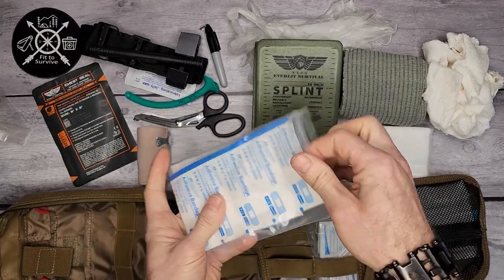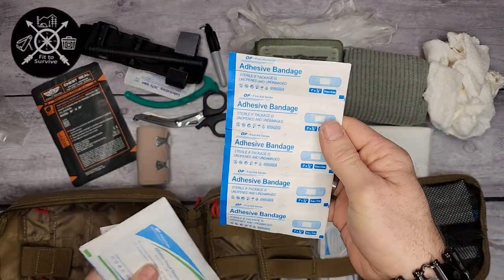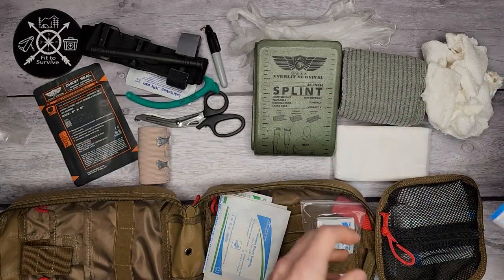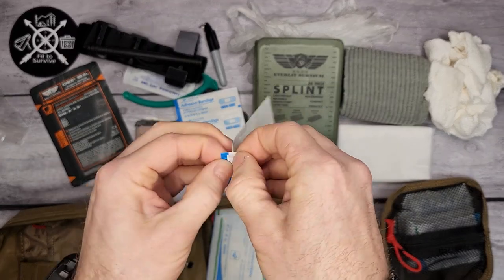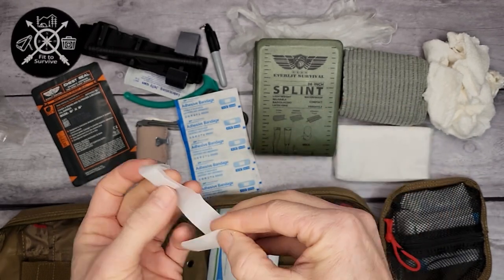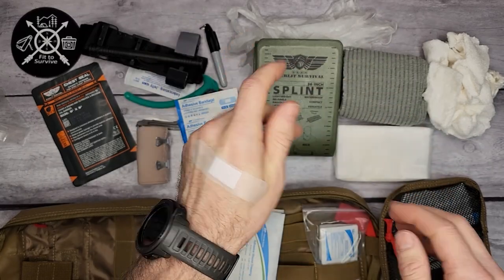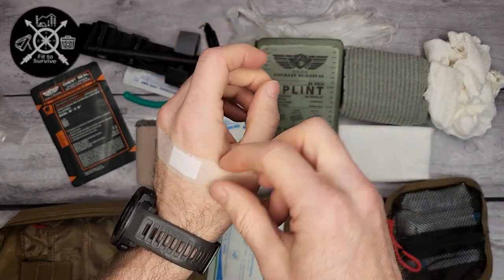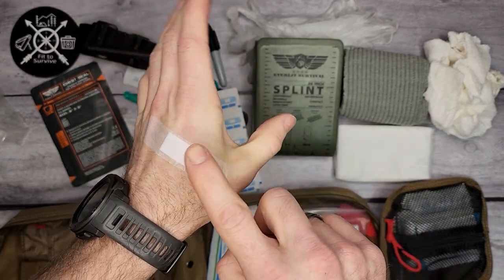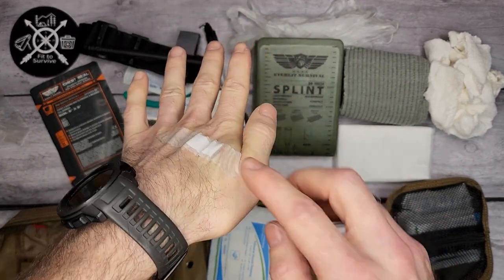There are some more different bandages and small items in a little Ziploc bag. There's a standard band-aid — it looks like an off-brand band-aid. Testing it out, it's actually a really thin band-aid along the sticky section, but it doesn't pop off when you bend your hand like cheaper plasticky band-aids do. This actually sticks really well. The band-aids are much better than I expected.